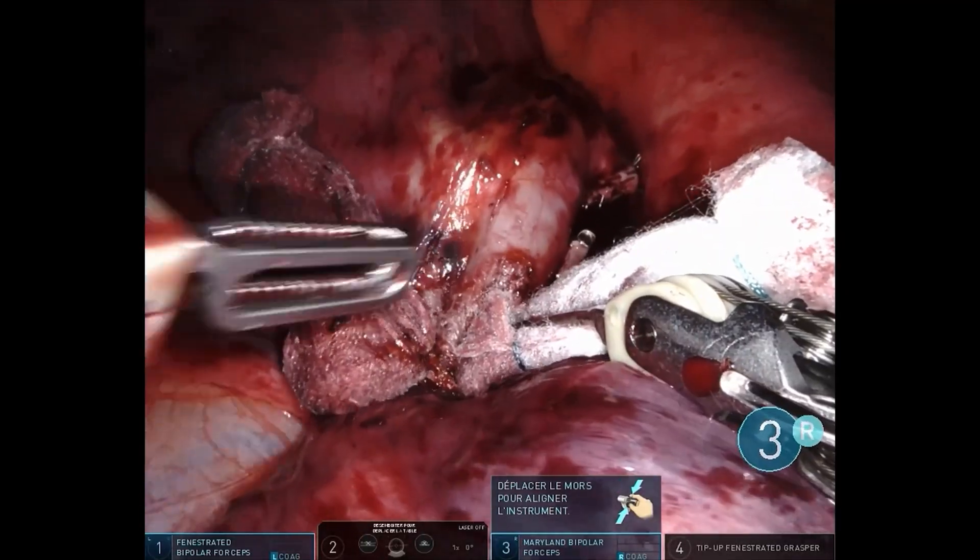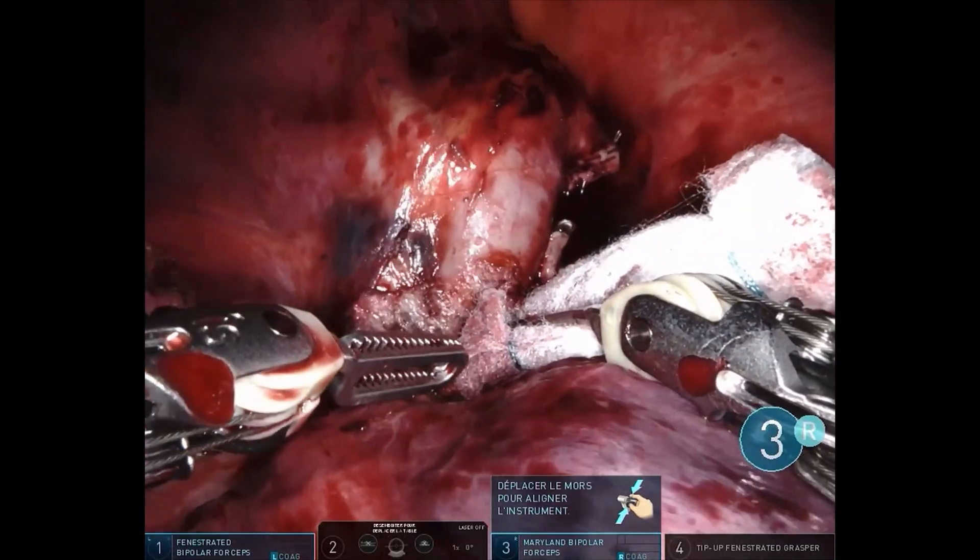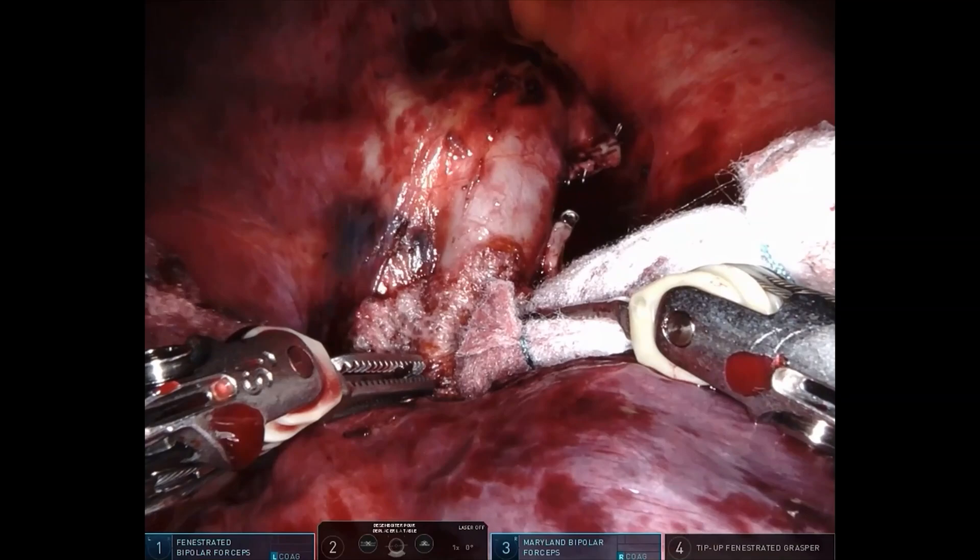After the compression period, upon removing the gauze, we observe complete control of the bleeding with no signs of active hemorrhage.